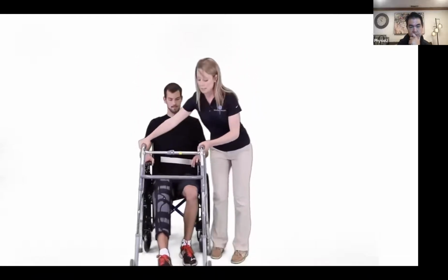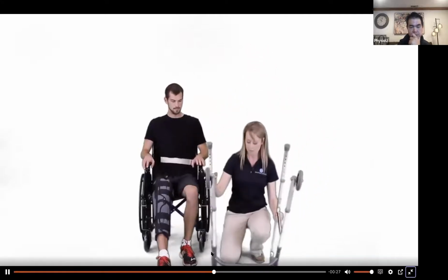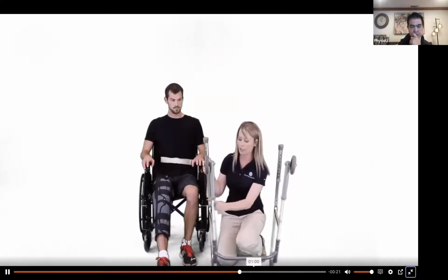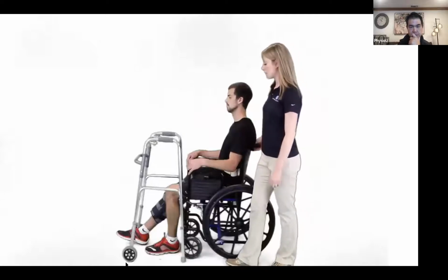I will then take the walker and turn it upside down. I will then press in the silver button and adjust each leg accordingly. In order to confirm the fit of the front wheel walker, you will have your patient stand up again.